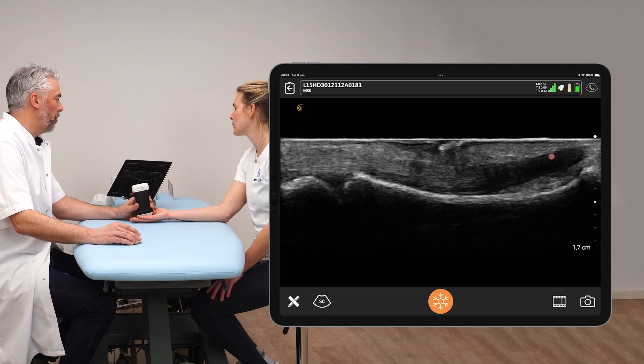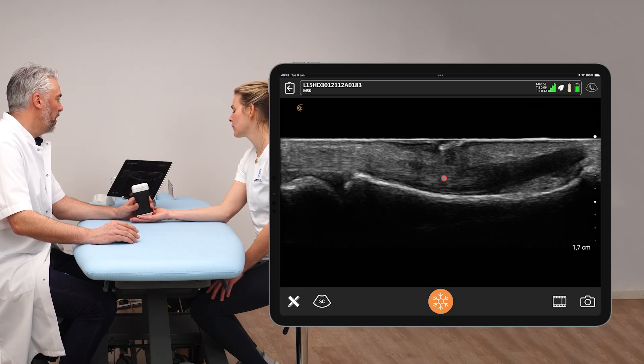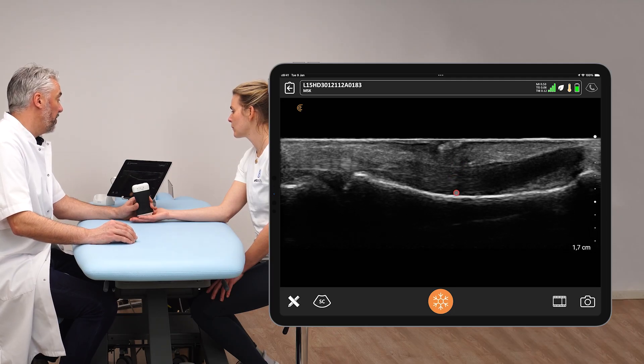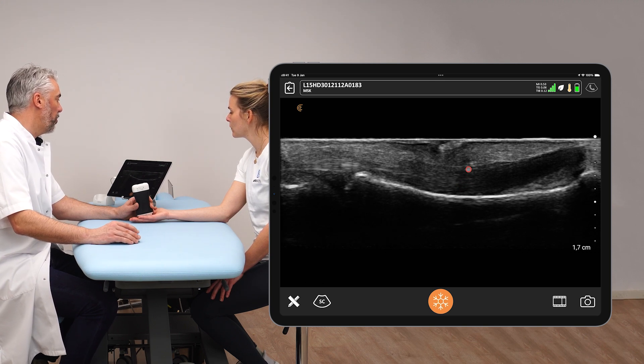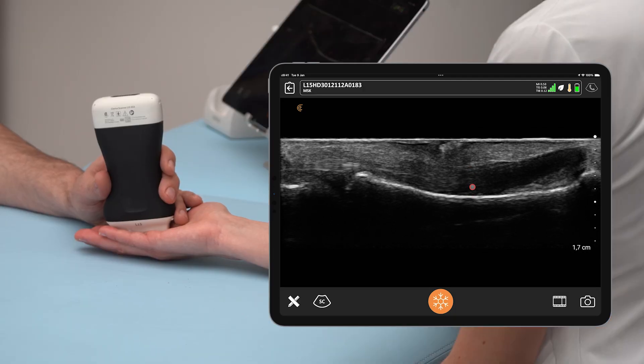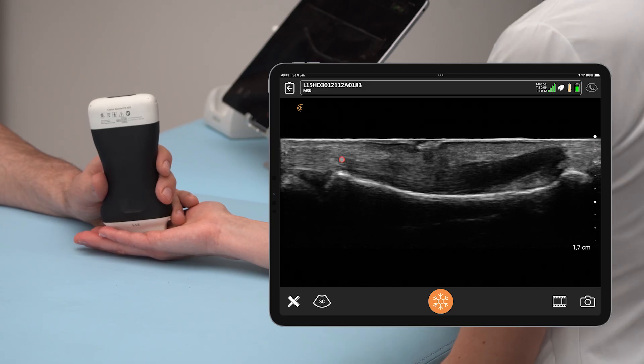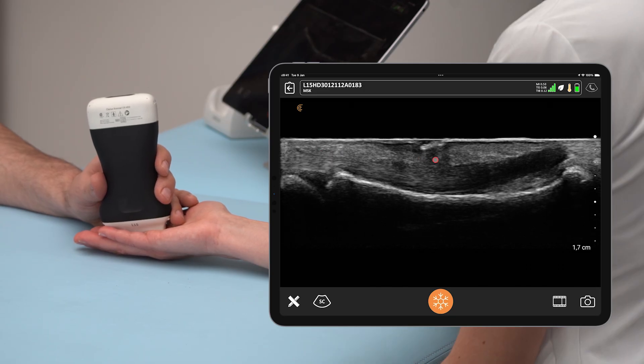We can see the tendon darkens a little bit due to anisotropy from the obliquity of the fibers. A possible injury is pulley tearing, which causes bow stringing — meaning the tendon moves away from the bone, coming more superficial. The tendon is no longer stabilized to the bone, which increases the tendon-to-bone distance. The tendon then takes a more horizontal course rather than following the curvature of the bone, which indicates that the A2 pulley has been torn.